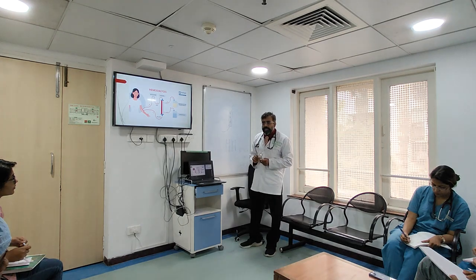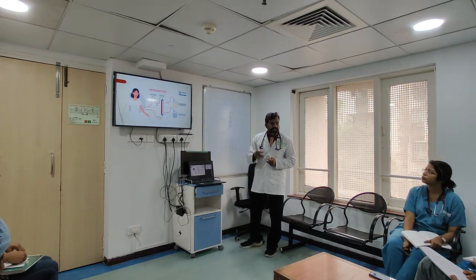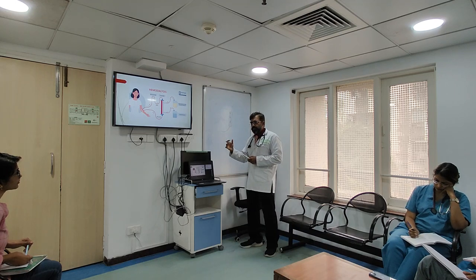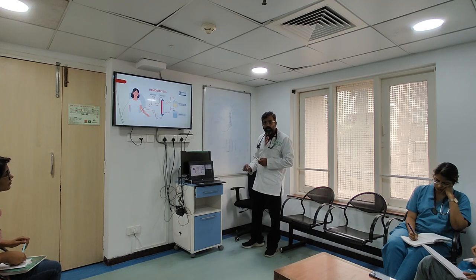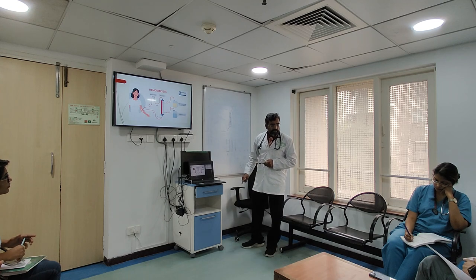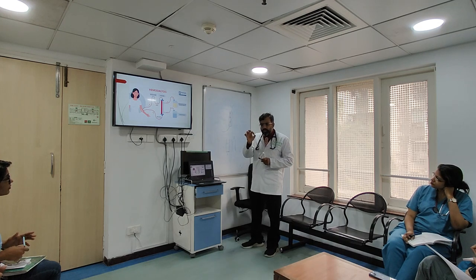Now my dialysate fluid has a very low amount of potassium. Let's take the example of potassium. My blood has a very, very high amount of potassium. So I've got a very high amount of potassium coming from here, that is my blood. I'm putting my dialysate fluid the other way around, where potassium is zero.